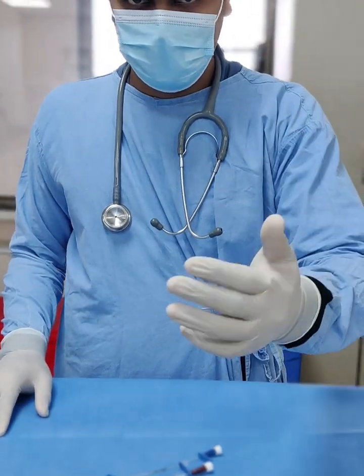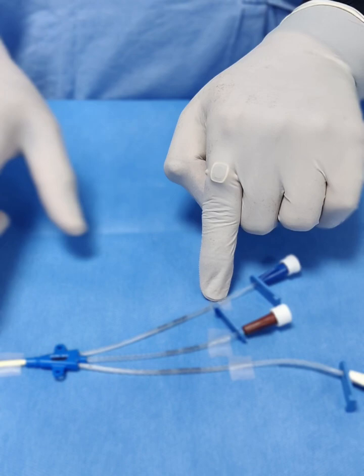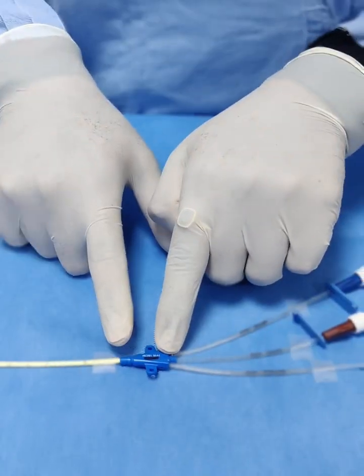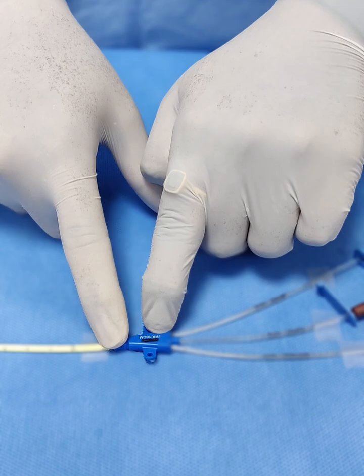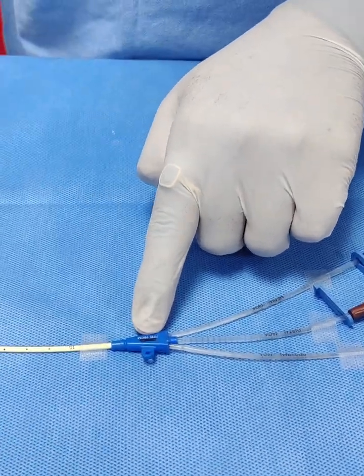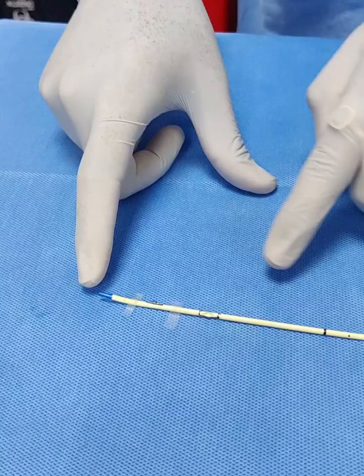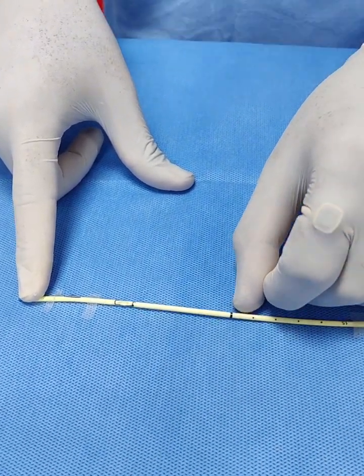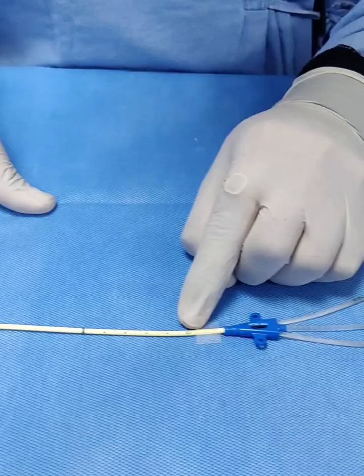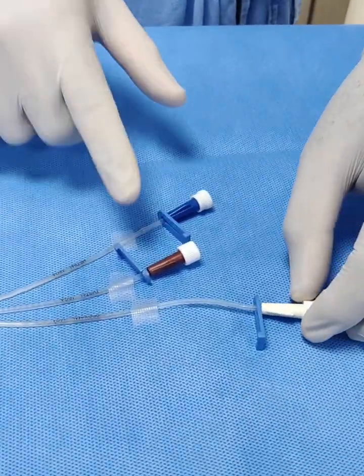This is a central line with three ports and their openings. It is size 7 French and the total length is 16 centimeters, measured from the tip end. The dark black line here indicates the 10 centimeter mark, and 15 is written here indicating the 15 centimeter mark.